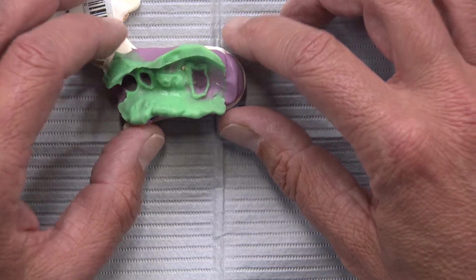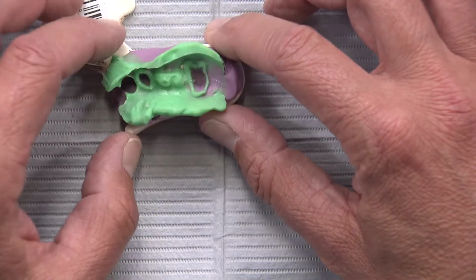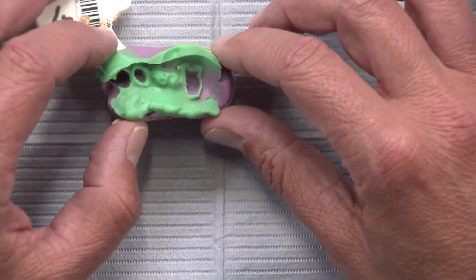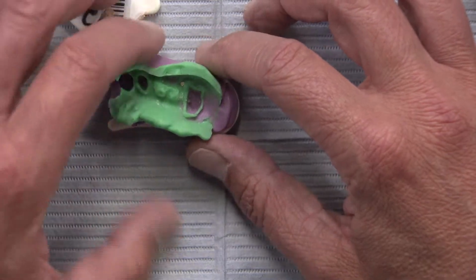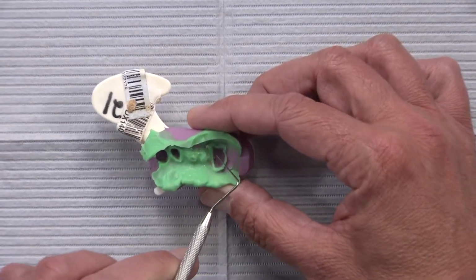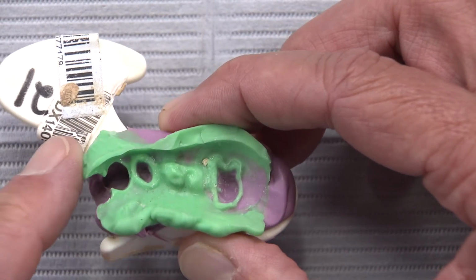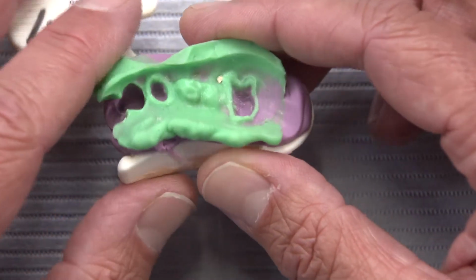In fact, some dentists don't even like to use it when you're taking an impression of a crown prep where you're doing the most distal tooth in the arch, because of the potential for overclosure and things like that. And so this kind of violates both of those things. And so you probably won't be surprised when you see the model. But before we get there, look at this as well: we've got our 4-unit bridge here, from the distal abutment to the mesial abutment, and then one other tooth essentially that we've impressed. Obviously, it's going to be pretty difficult to get a centric stop, let alone any kind of excursions, without having an impression that goes around the rest of the arch.